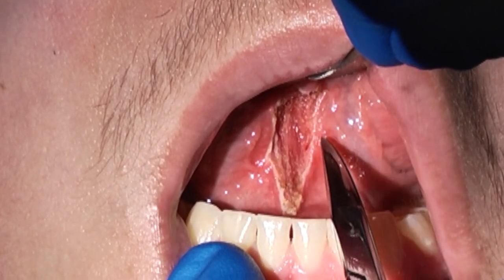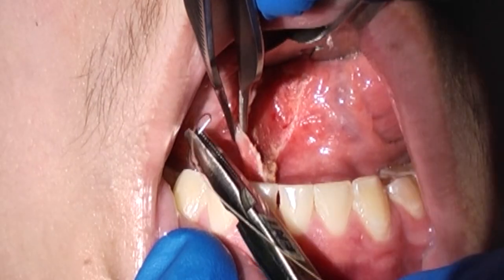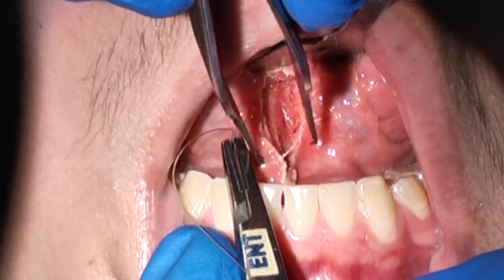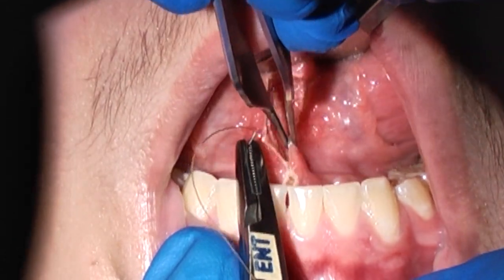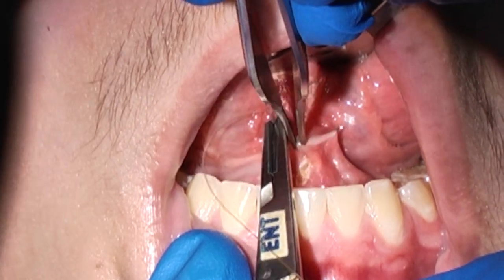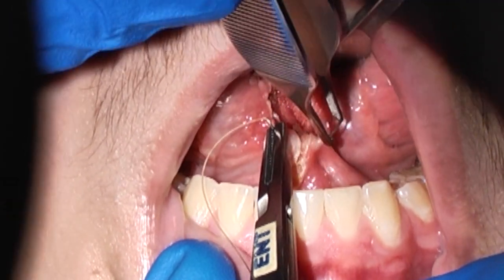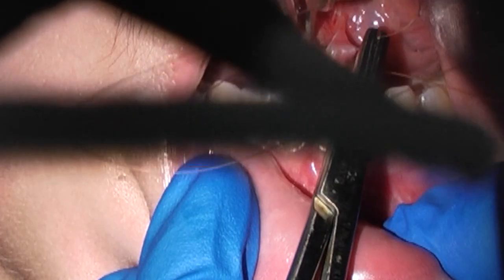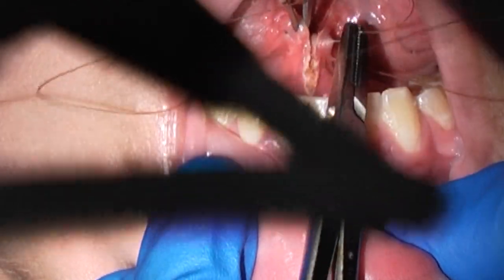Here we see the residual defect on the ventral surface of the tongue, which is then closed in a vertical fashion using chromic gut suture with a taper needle, typically a 3-0 or 4-0 stitch. This can be done either as interrupted or as horizontal mattress sutures and is simply used to approximate the mucosal edges to speed healing.